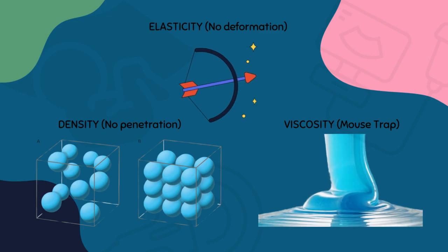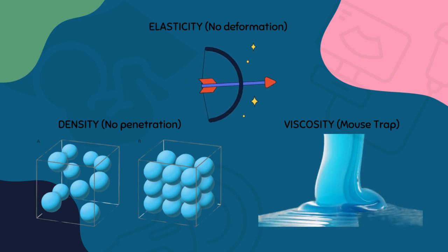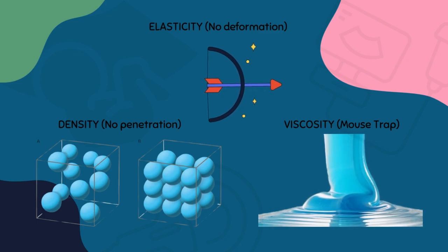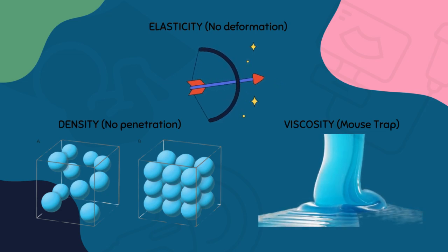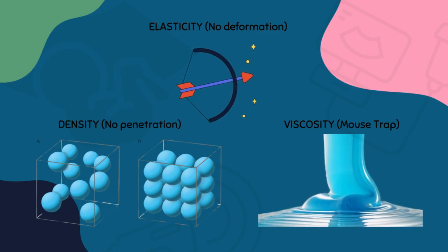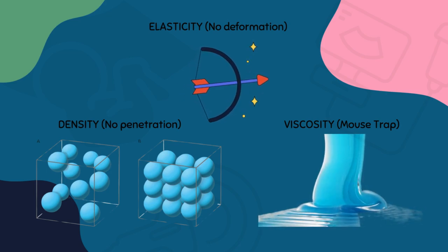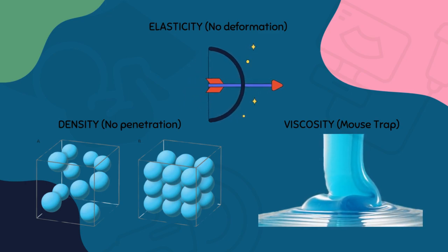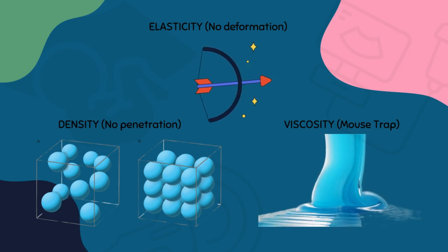affect sound transmission. Dense structures which have very little intermolecular spaces will not favor penetration of sound waves through its entire thickness, as very little sound waves will escape through the pores to the other end of the tissue depth. Therefore, more sound waves will bounce off the molecules and be reflected or propagated away from the tissue surface as echoes directed towards the transducer.